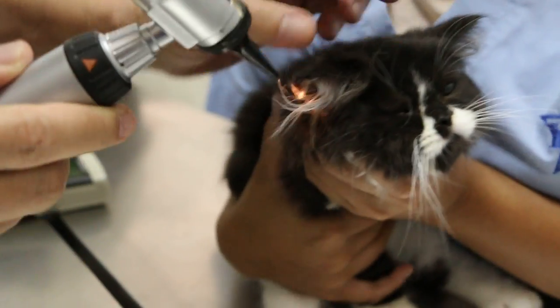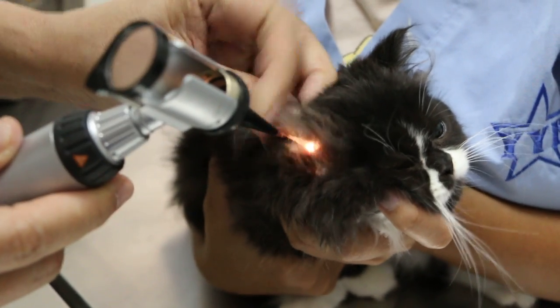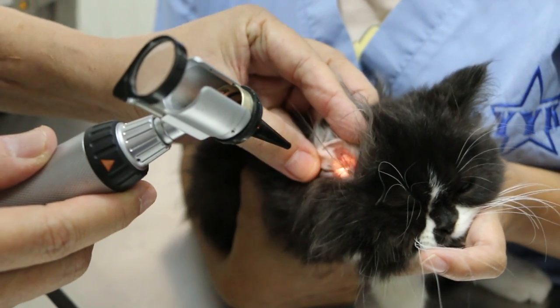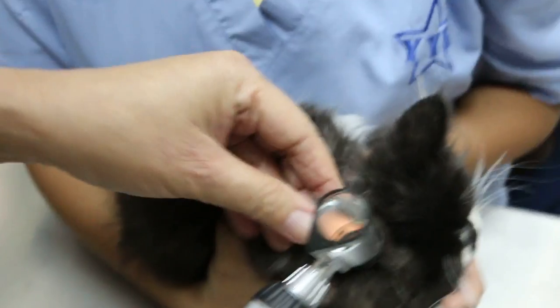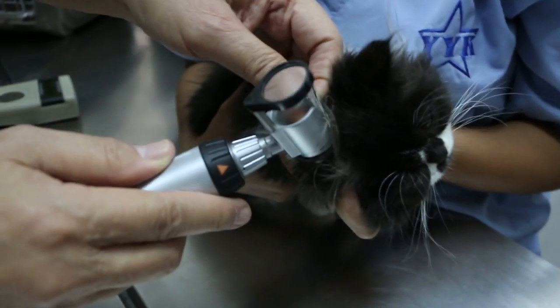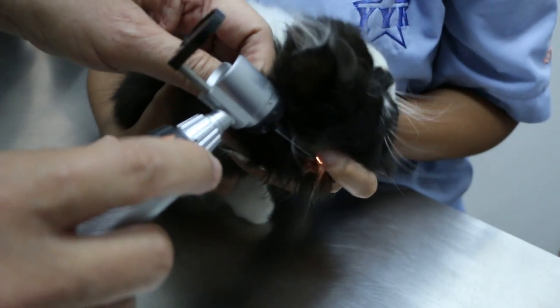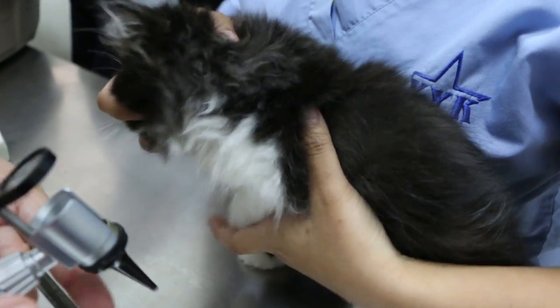Besides the physical examination, let me just check. Physical examination shows it's very clean in the ears. No ear wax, no hair loss. So just scope, show the scoping. The scope can show any ear mites or any wax or dirt or ulcer. And it shows that there's nothing. The otoscope is being used on both ears.